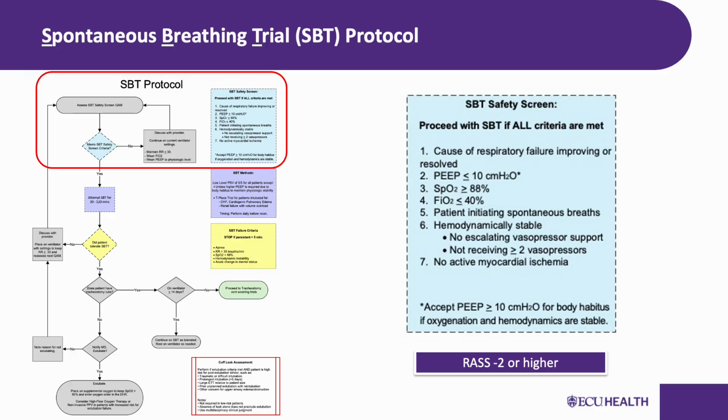Coordination between respiratory therapy and nursing. Before you proceed with SBT, you need to review the patient's RASS to confirm they are at the right level. RASS stands for Richmond Agitation Sedation Scale, and it is assessed and documented by nursing as part of their workflow. Our job as RTs is to review the RASS score before we proceed.